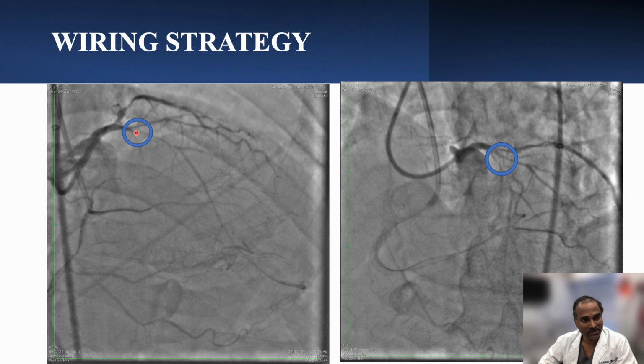Once we do a cap puncture with IVUS, you can advance the wire, and most important is your distal vessel is quite well visible, so it guides you pretty well in advancing the antegrade wire after escalation.